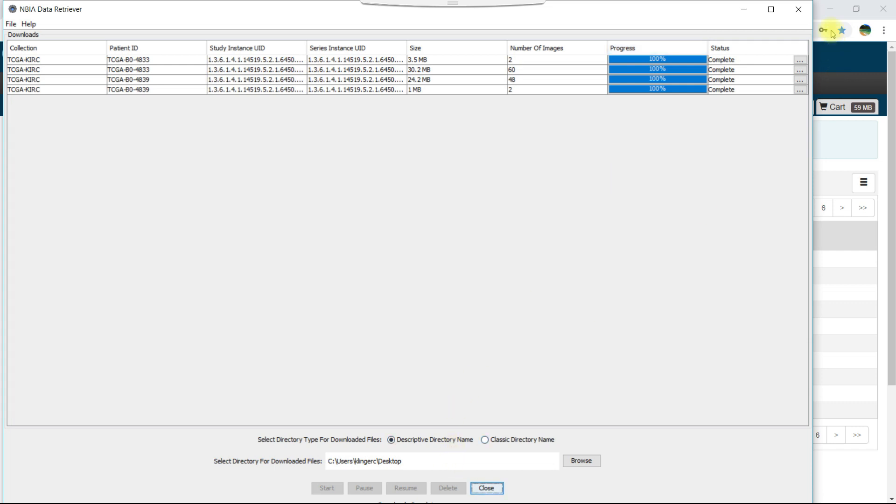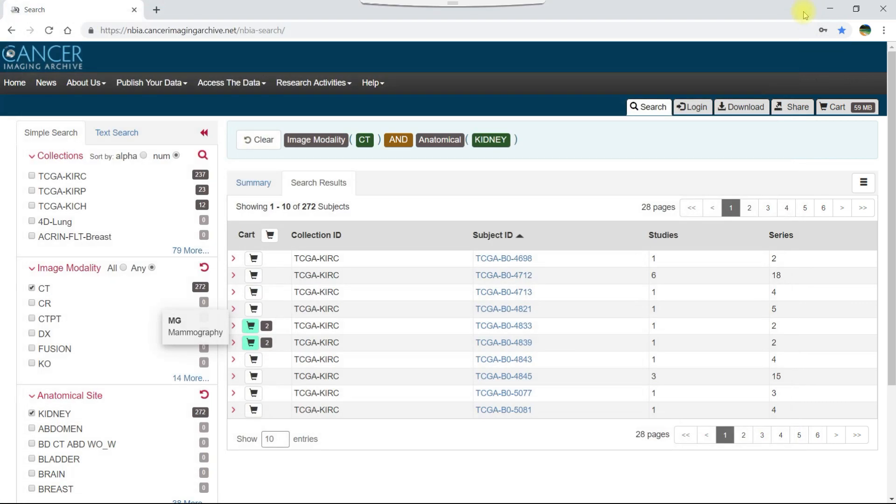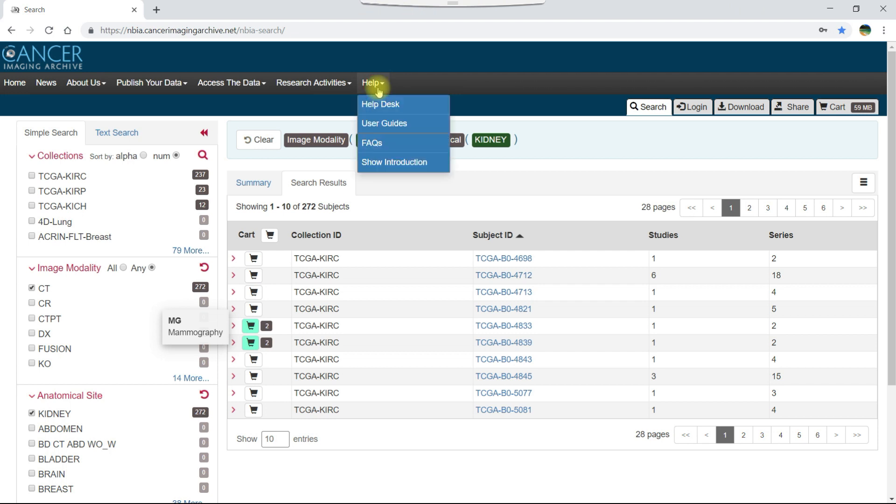If you need more help with the TCIA data portal, refer to the help menu where you can find links to the help desk contact information, the TCIA data portal user guide and other guides, frequently asked questions, and the introductory tutorial. Thank you!